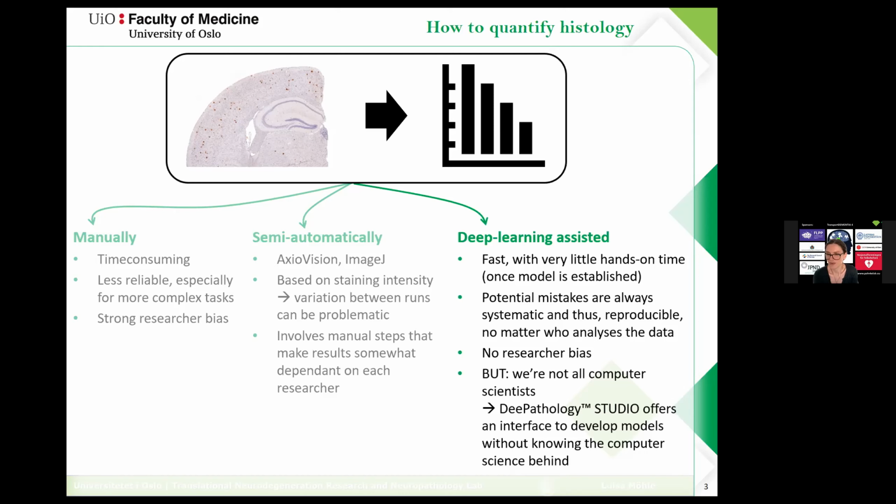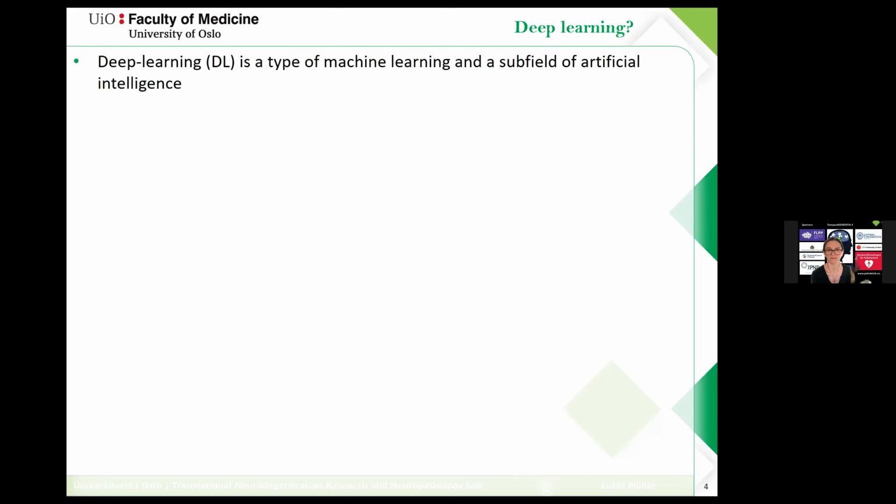Now, the issue is that, of course, we're not all computer scientists. And for that, DeePathology STUDIO offers an interface where you can develop models without knowing any of the computer science behind, and you don't ever have to touch code if that's what you're worried about.